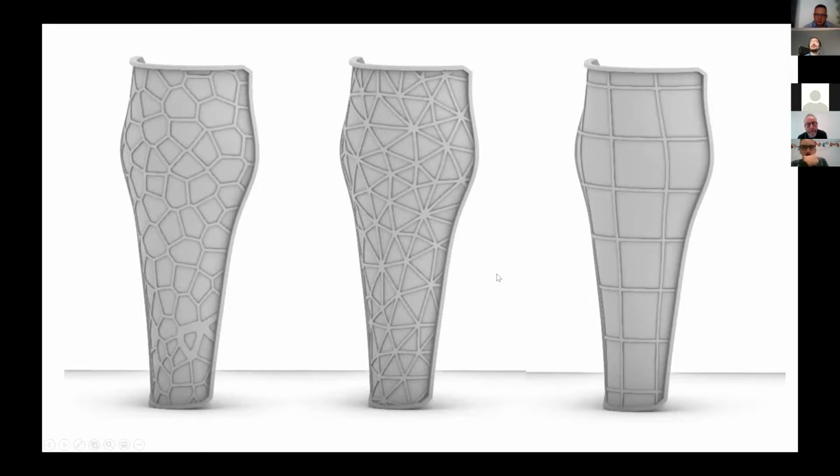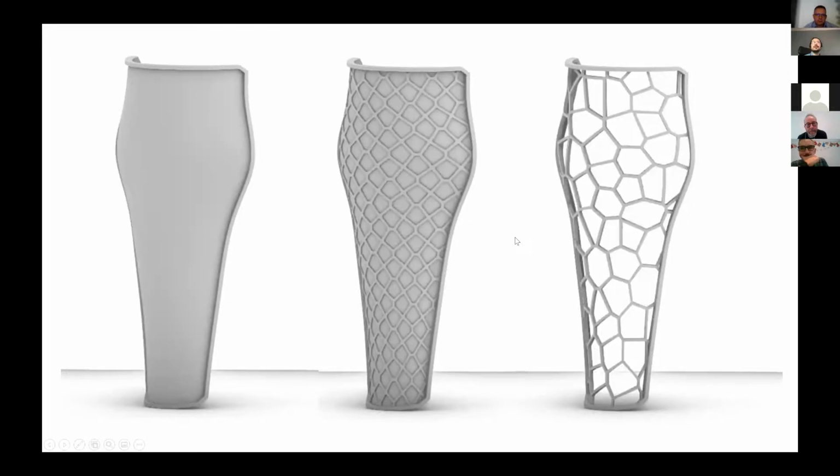So here are a couple of different alternatives. We have different patterns depending on what the customer likes, like a Voronoi pattern, a Delaunay pattern, or just a square pattern. Or a smooth pattern, a sort of pentagonal pattern in this case, where you can adjust angles and so on. And there are also various options for having see-through holes or areas where you can see through the pattern.